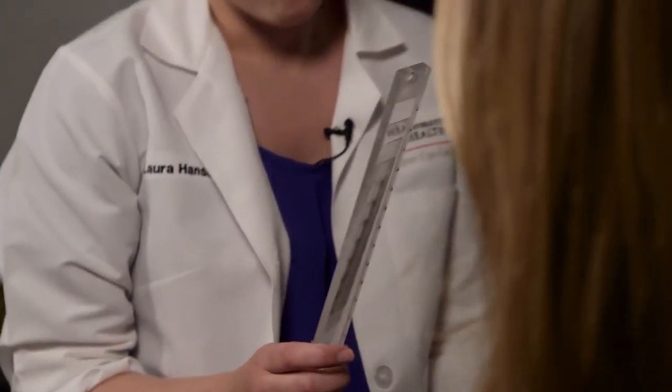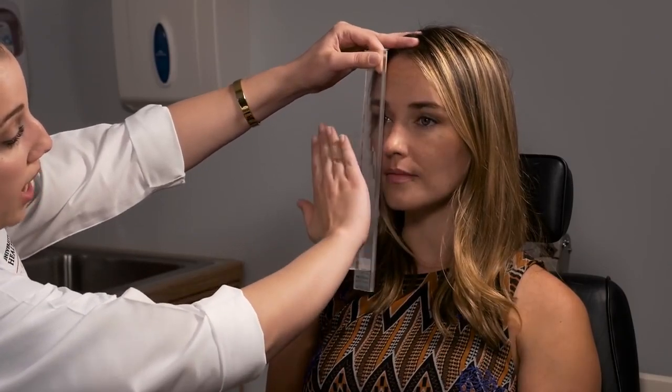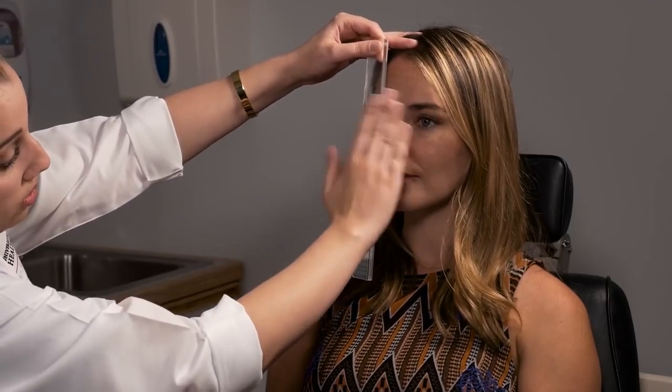And so if you're looking to measure a deviation, you point the apex in the direction of the deviation, you hold it over one eye, and if you want to measure a phoria, you do the cross-cover test, adding increasing amounts of prism until you've neutralized the deviation. For her, I'm actually inducing one because she's very well aligned.